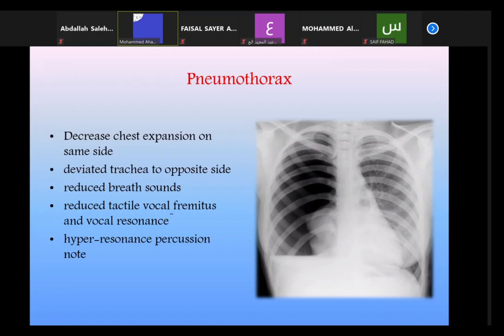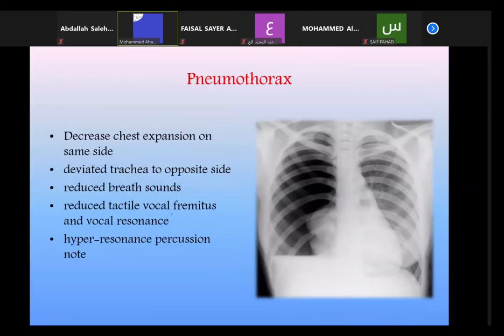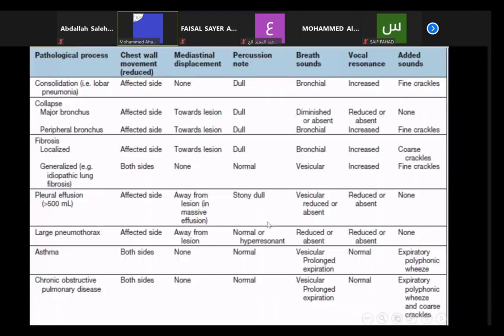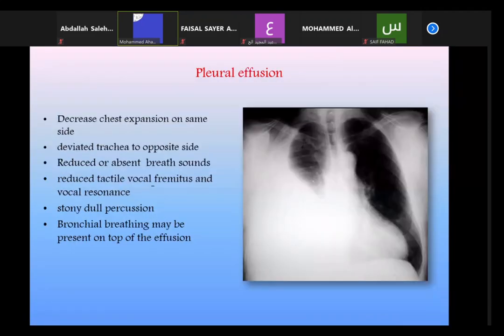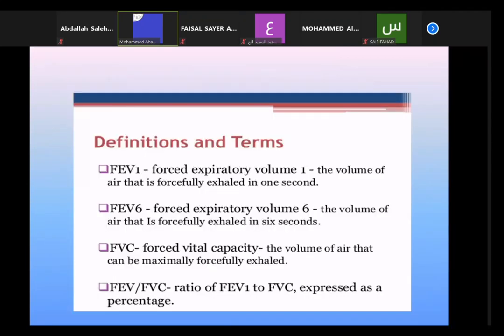شباب معك دكتور. طيب ديل صورتين أشعة صح؟ أيوه طيب نعم. حاجيب صورة بتاعت نيموثوركس احفظوا لي الحاجات من هنا، وحاجيب صورة بتاعت consolidation احفظوا لي الحاجات من هنا، ونمشي آخر حاجة. أو حاجيب الحاجة من الكلابينج ديك واحدة. نمشي آخر حاجة.